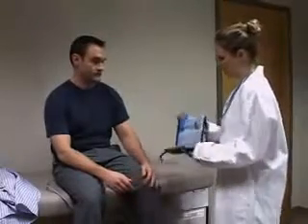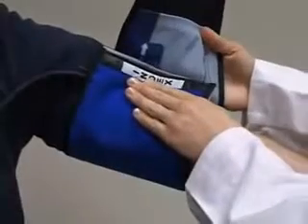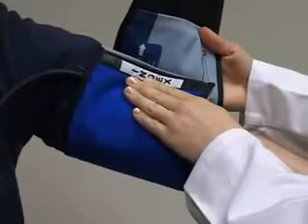Next, check the patient's upper arm circumference to determine the appropriate size cuff to use for the study. The index marker should fit into the range indicator. If it does not, choose the appropriate larger or smaller size cuff.